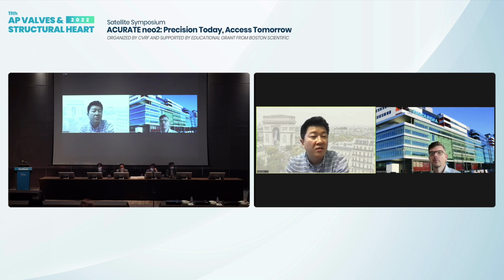Coronary access is possible in most cases, but this is for diagnostic coronary angiography. You have seen in the example I've shown you, there's a difference between diagnostic coronary angiography and PCI. The requirements for backup are much different. If you look at the numbers only for diagnostic coronary angiography, it is 90%, 95%, which is good. But if you think of coronary access in native anatomies, it's 100%. So I think we really have to think about coronary access, and this is becoming more and more important when we try to take into account lifetime management. So patients coming back with a valve. This will be increasingly the case also in Korea.